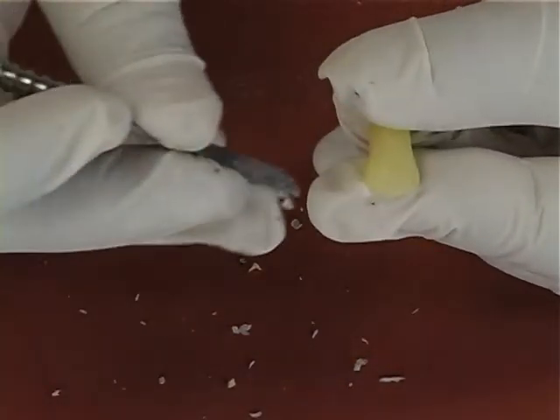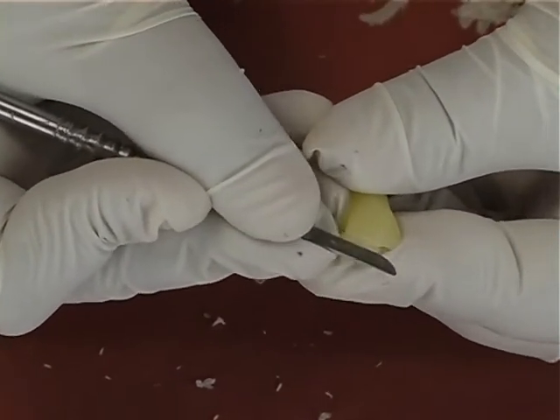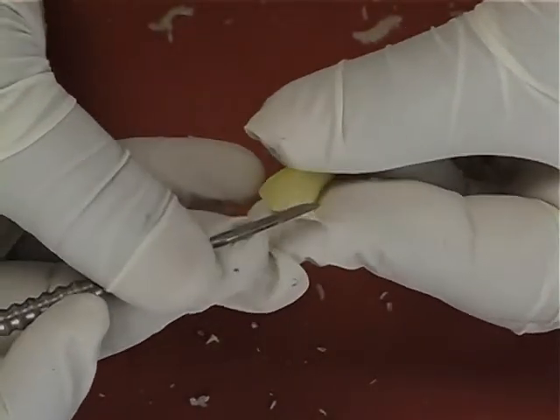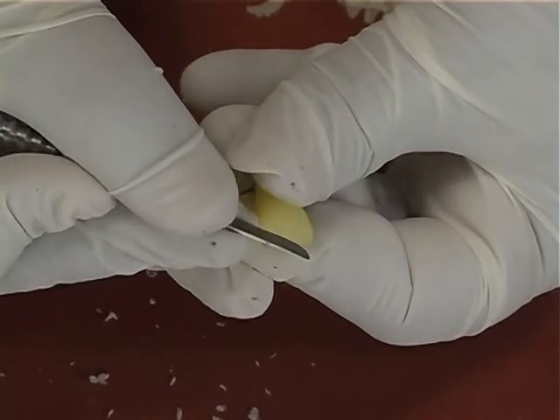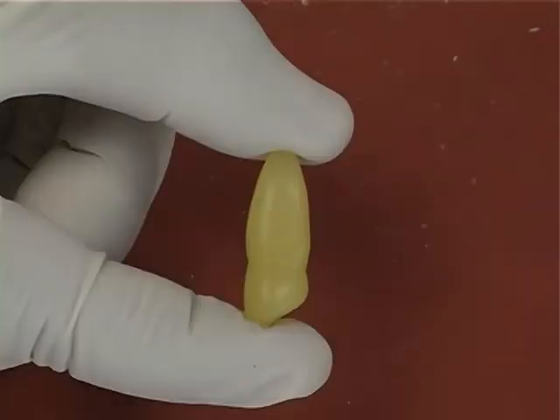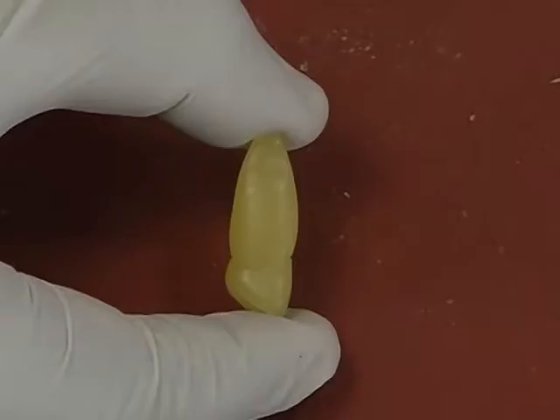Then the cuspal slopes are rounded so that the canine cusp becomes prominent. This is the completed labial aspect, mesial aspect, palatal aspect and distal aspect.